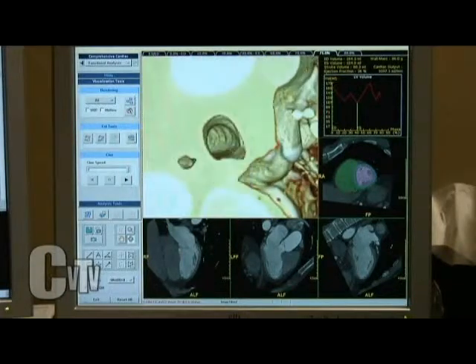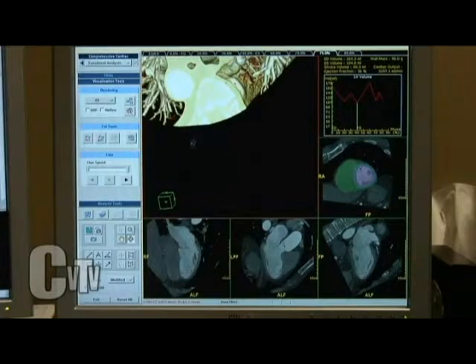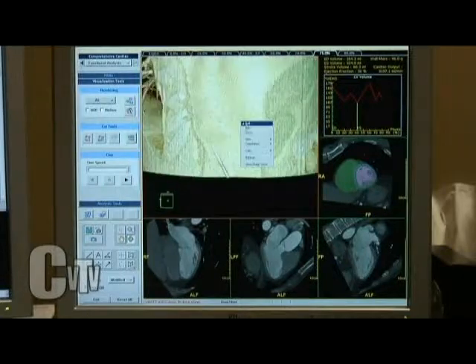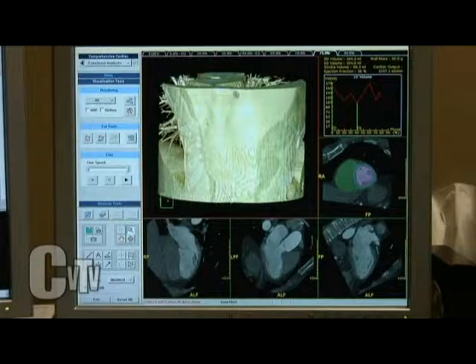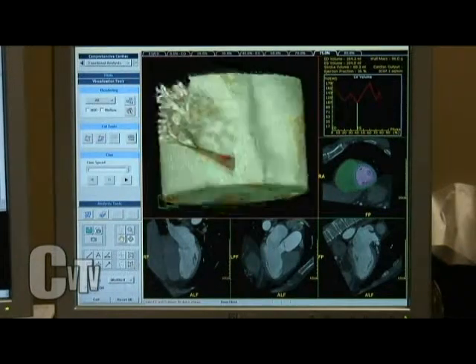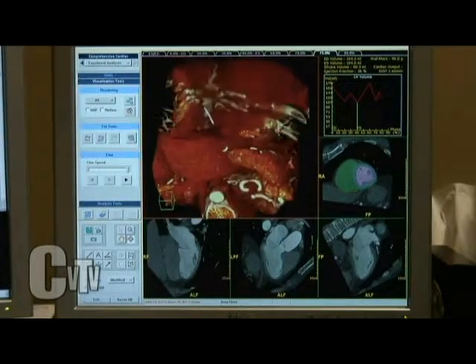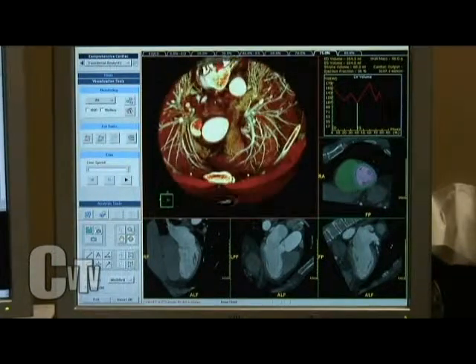All that looks good. And then lastly, I call this the realm of stupid CT tricks. There's the whole scan and the lungs, liver, spleen, all of that. There you are from the bottom. Stomach here, liver. There's the spine, spinal cord, aorta, and the top.